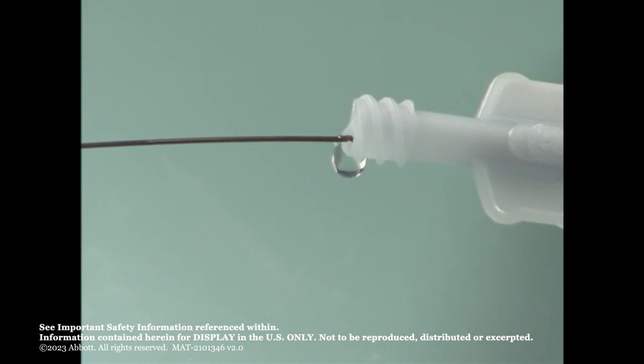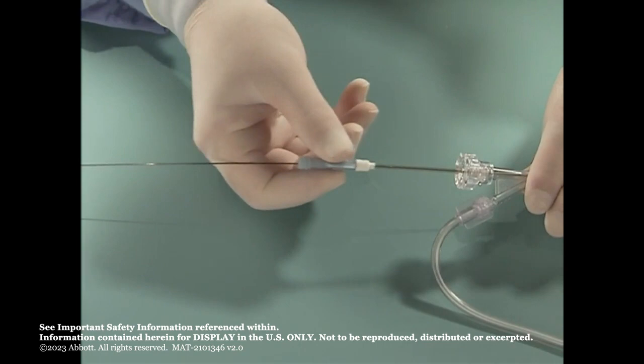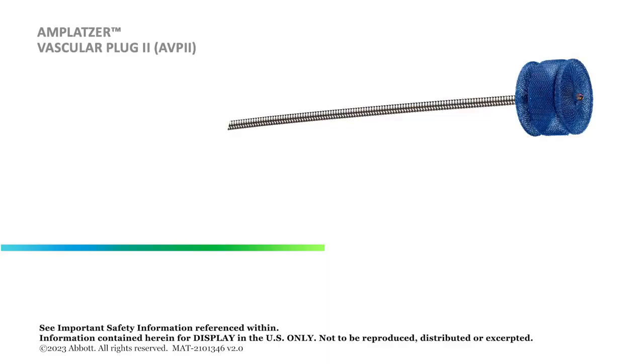Allow blood backflow or aspirate the system to remove all air. After the Amplatzer Vascular Plug 2 has been transferred into the delivery system, remove the loader if desired.